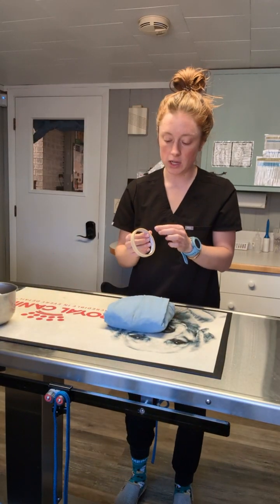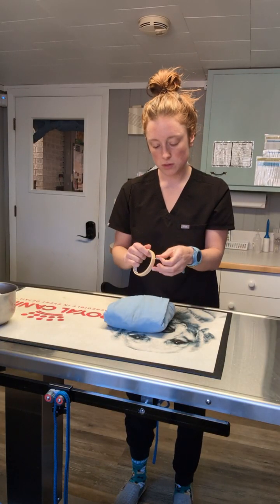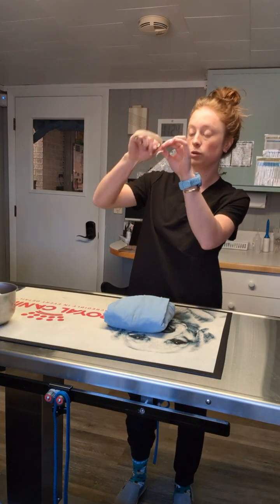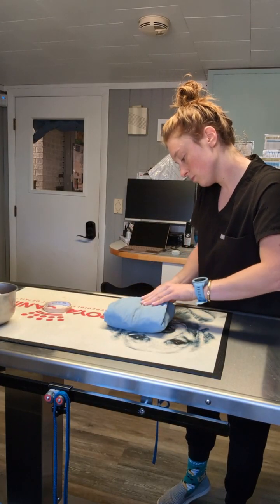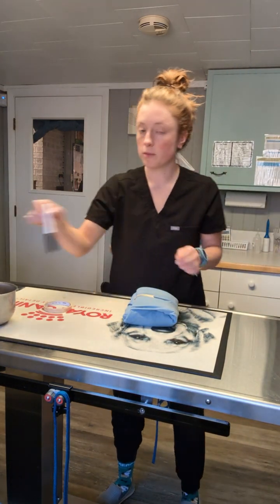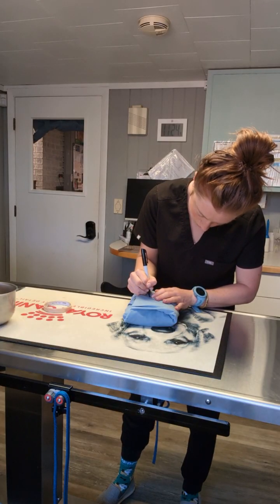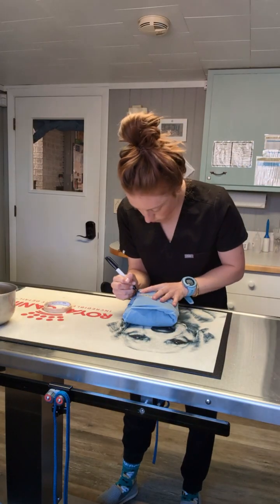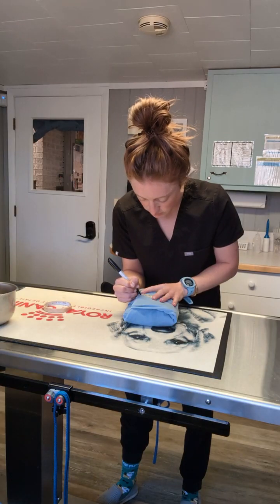Then we also have steam indicator tape that we will use to secure this pack closed. I'm just with a Sharpie, I'm gonna write the date, my name, and what type of pack it is, so laceration.